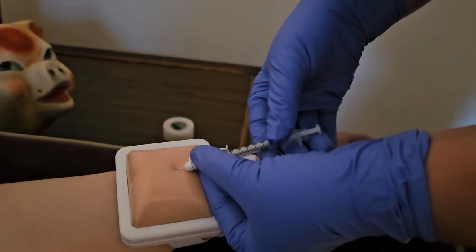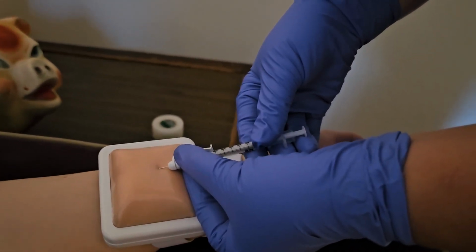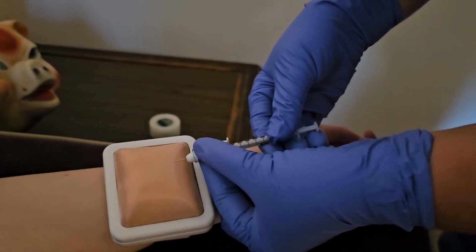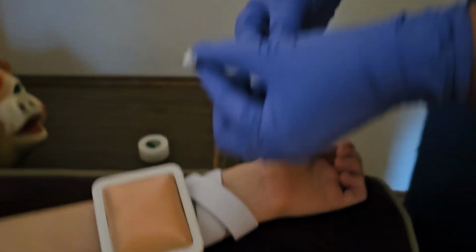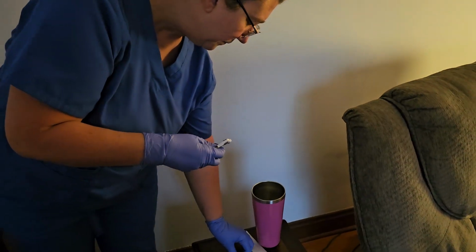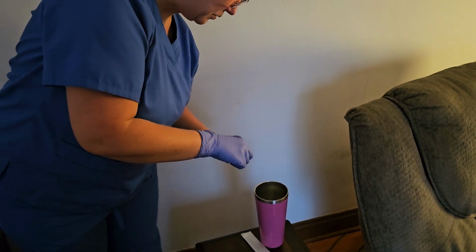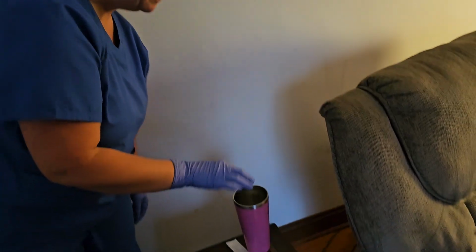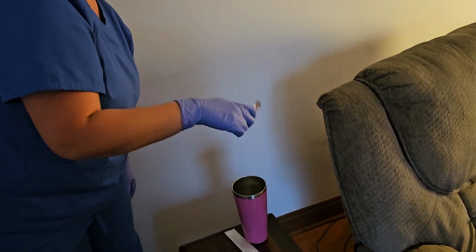Now, we went in at 5 to 15 degrees, so we're going to come out at 5 to 15 degrees. We are going to activate the safety of that syringe. I capped it because it's our video, but we're going to activate the safety of the syringe and put it in the sharps container.